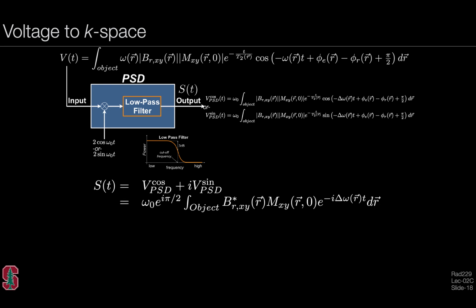And the combination of these signals is what actually results in a signal that's a function of time, because we were recording information over time. And this signal is kind of interesting because it's how the transverse magnetization becomes detected as a complex signal through so-called phase-sensitive detection. We get phase information as well as the magnitude information. And it's information in the rotating frame as well, because we've demodulated through low-pass filtering the baseband frequency on resonance with the Larmor frequency, for example.